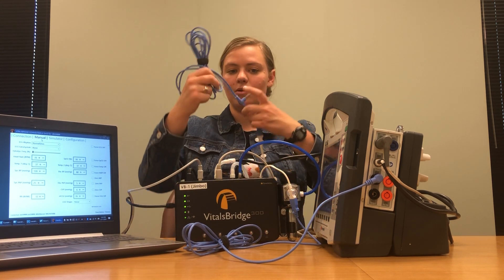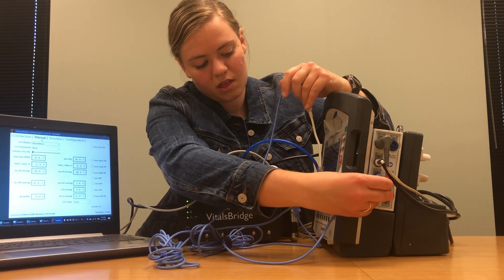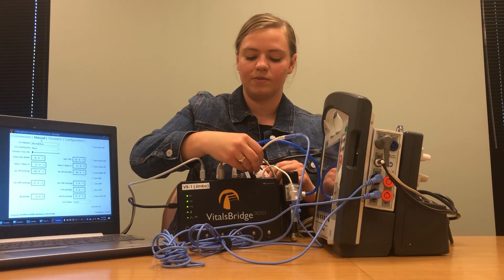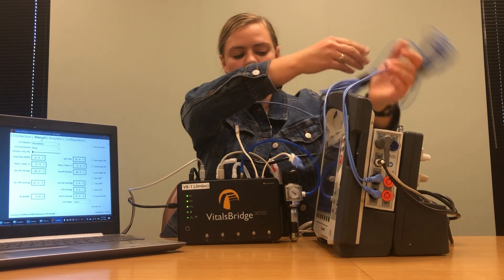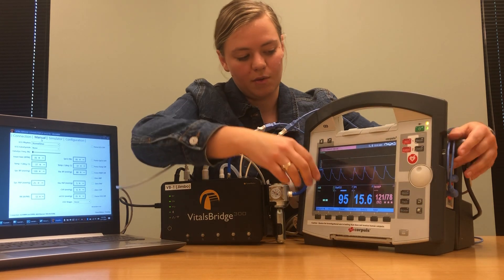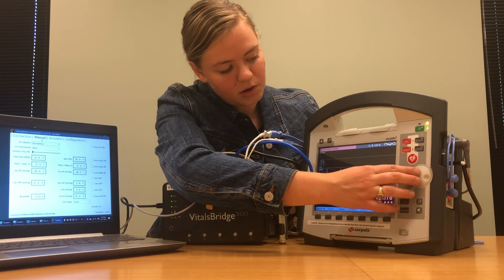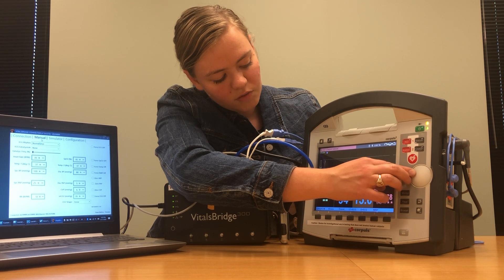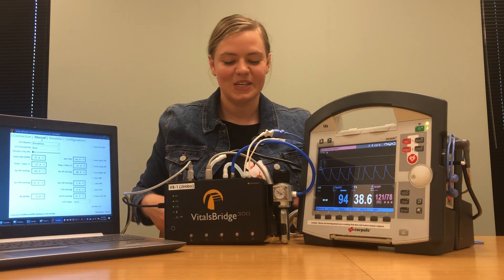Do the same thing with the second cable where it says temperature two, and plug that end into T2. The default screen for the Core Pulse patient monitor doesn't show temperatures, but that's easy to fix the same way we fixed the SPO2 waveforms — come down to whichever vital sign you don't want to see and change it to show whichever temperature you'd like. I'll set it to show temperature one.